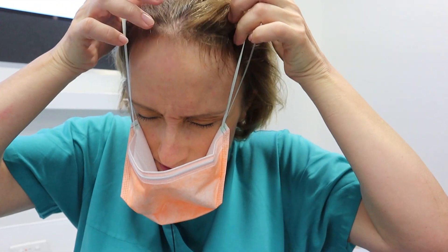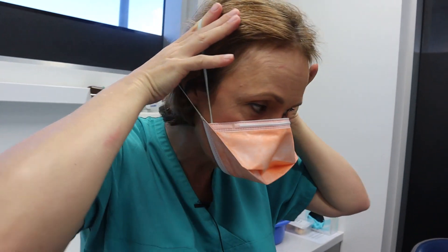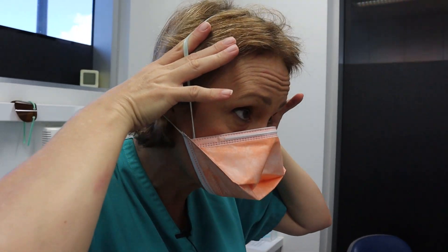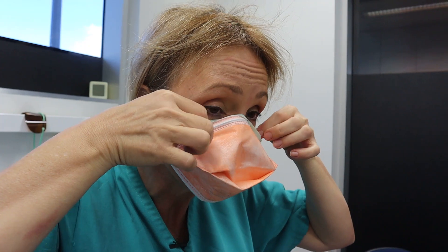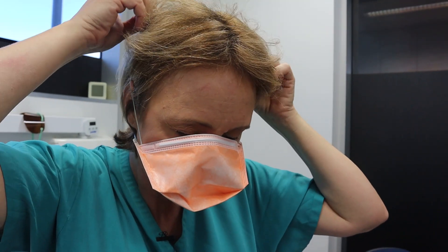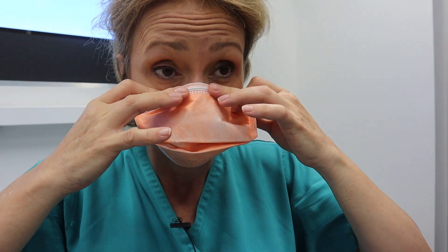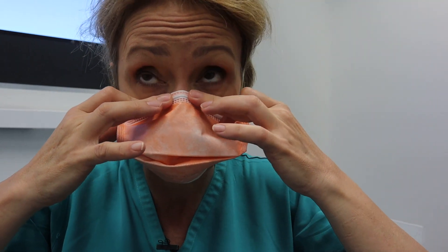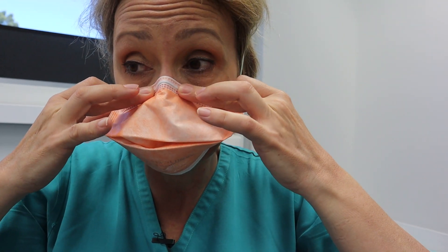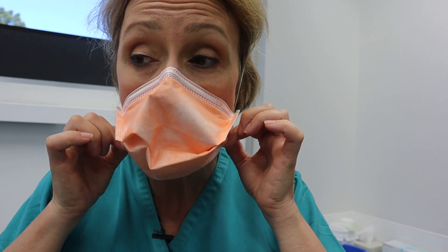It sits this way, and one of the straps stays above the head but the ear one stays below the ear. Then we cup the metal part over the nose for a snug fit — make sure it goes under the chin.